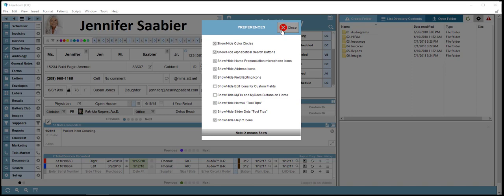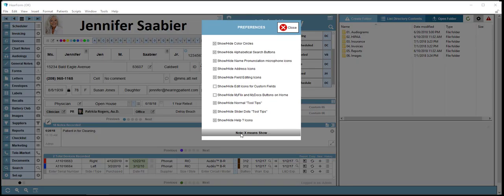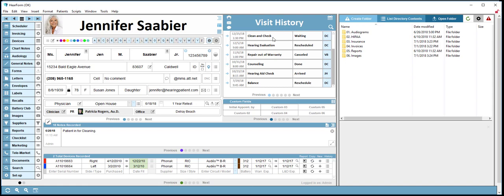You'll also notice that when I click a button, we now have something called card windows, and those card windows will actually take the background and make it dimmed out a little bit and bring focus to the front window, but you don't have to leave the screen now in many of our different pop-ups, as you'll see later.